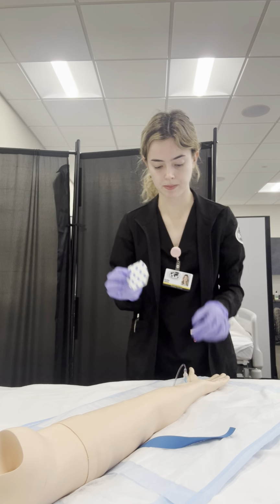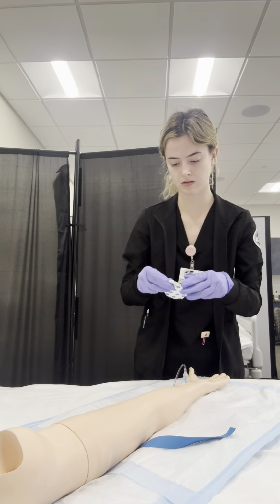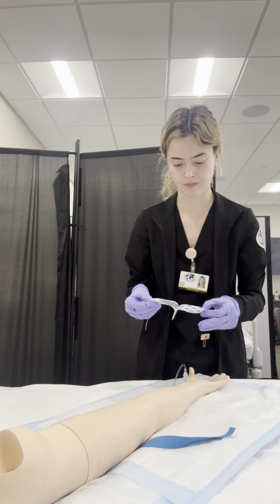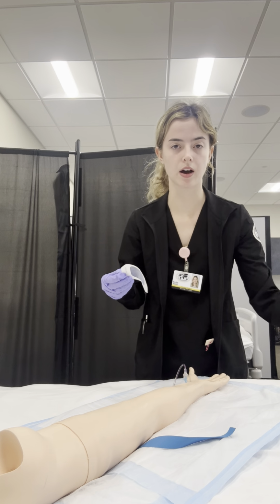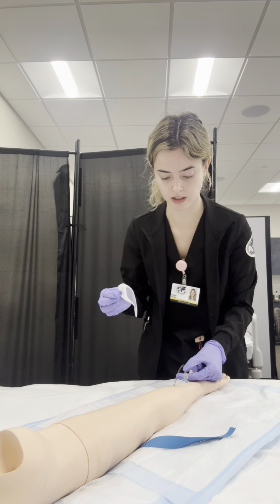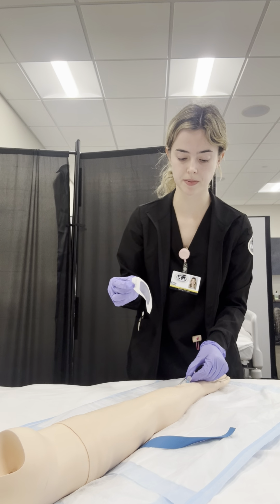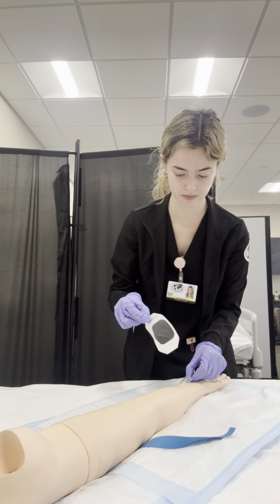So I'm going to take my transparent dressing and I'm going to apply that over top of the insertion site. I want to make sure that I can still see the insertion site, but that it is completely covered.